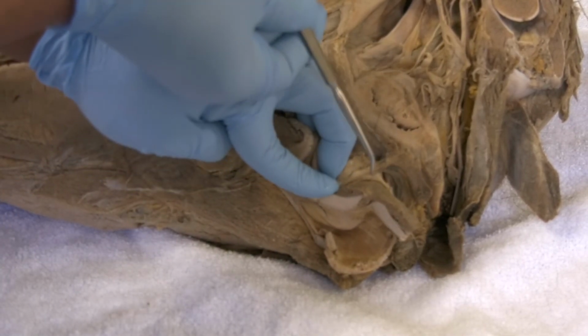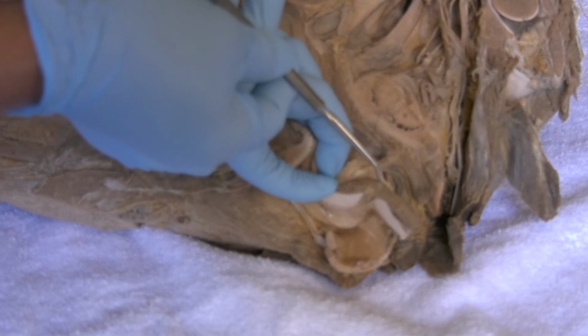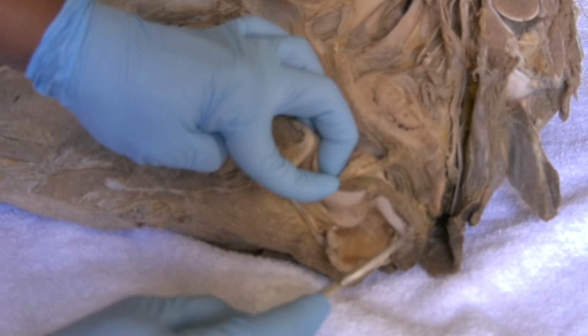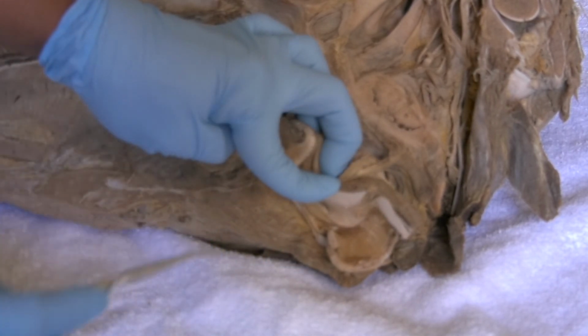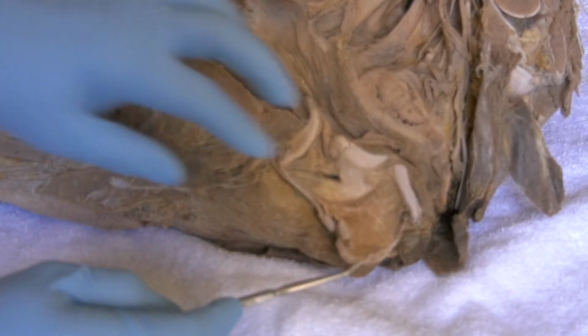So in the tie-back procedure, you make your knot in between the cricoid cartilage and the muscular process of the arytenoid cartilage.